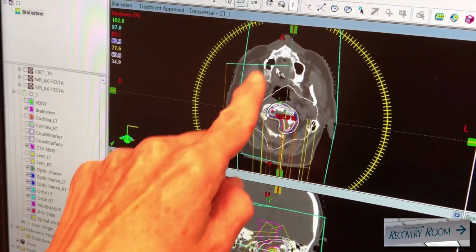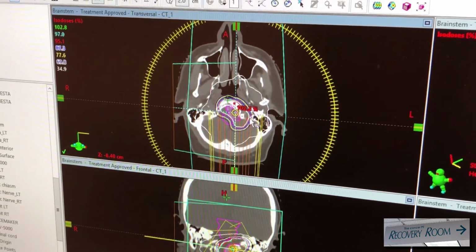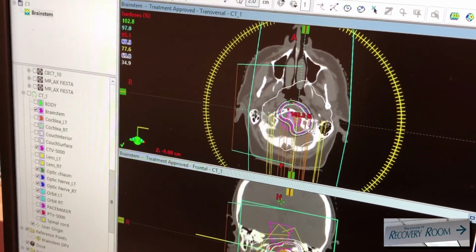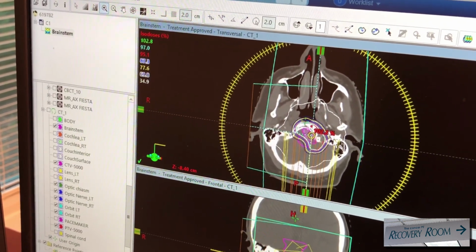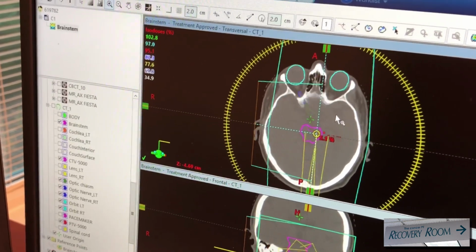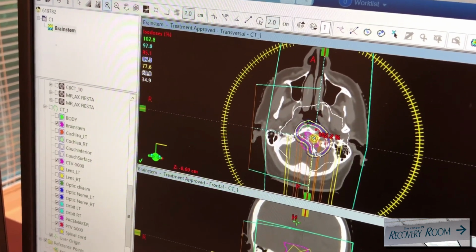So as we're coming down, this is his mouth. So as I'm scrolling through, you're going to see something pop up that's in this pink color. So this pink volume defines the target. On each slice, I contoured this volume right there. So my target is this pink volume, and I also highlighted organs at risk, such as the brain stem, which is hiding right next to it. And also going up, we would outline his orbits and his optic nerves and his optic chiasm. So the goal is to hit the pink tumor area and leave everything else alone. Right. So when we came up with our radiation plan, the dose is this volume right here. So it bends around this brain stem here.